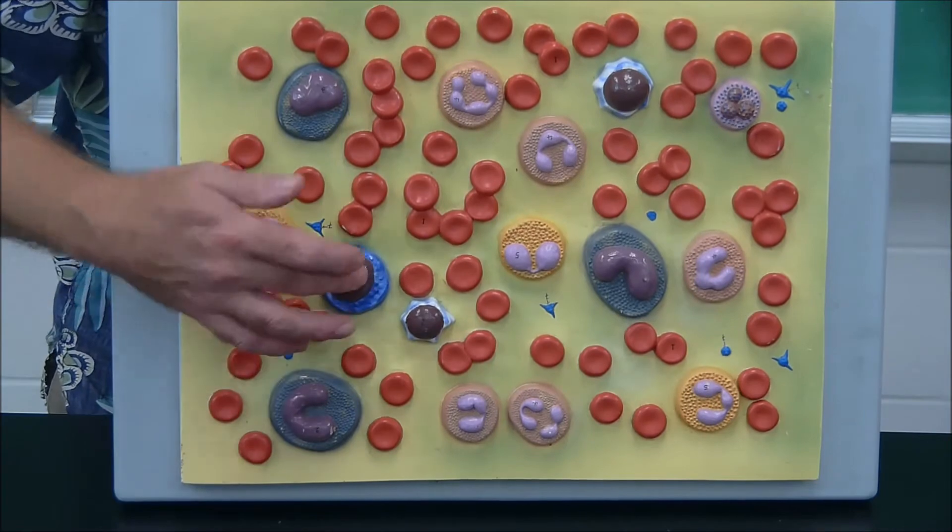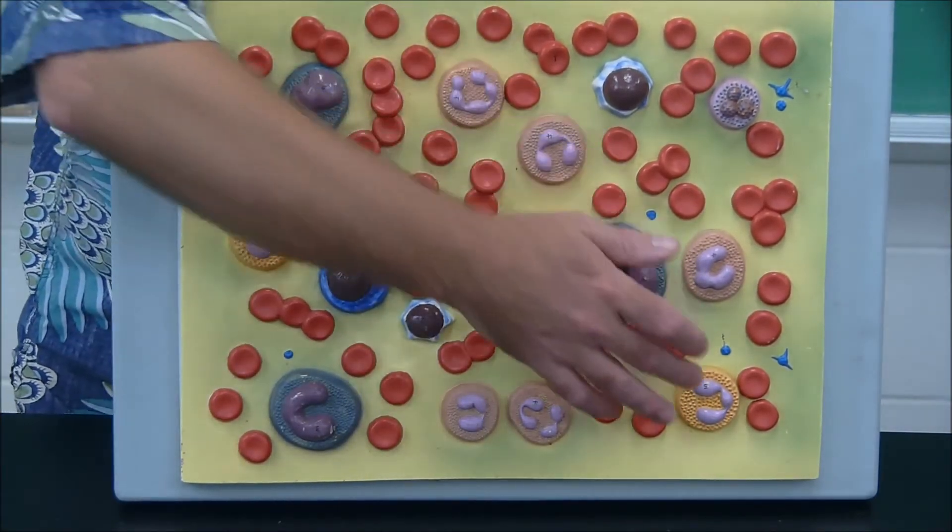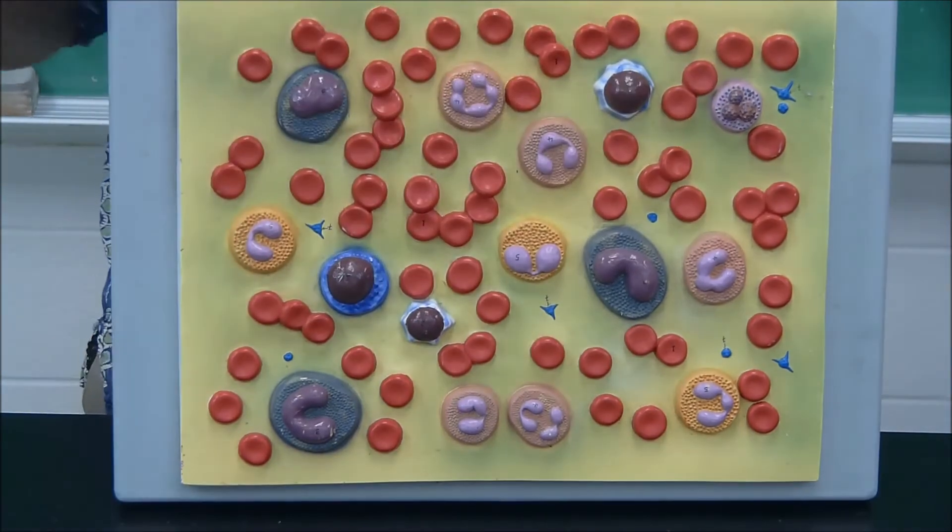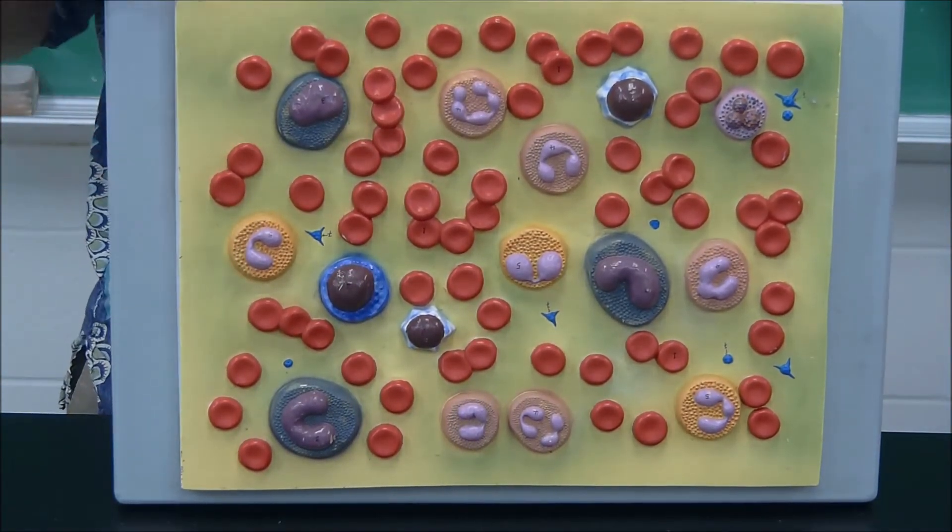So let's see, 1, 2, 3, 4, 5, 6, 7, 8, 9, 10, 11, 12, 13, 14, 15. Okay, so 15 total white blood cells here, and we're going to identify each one of them and put them into one of the five categories.